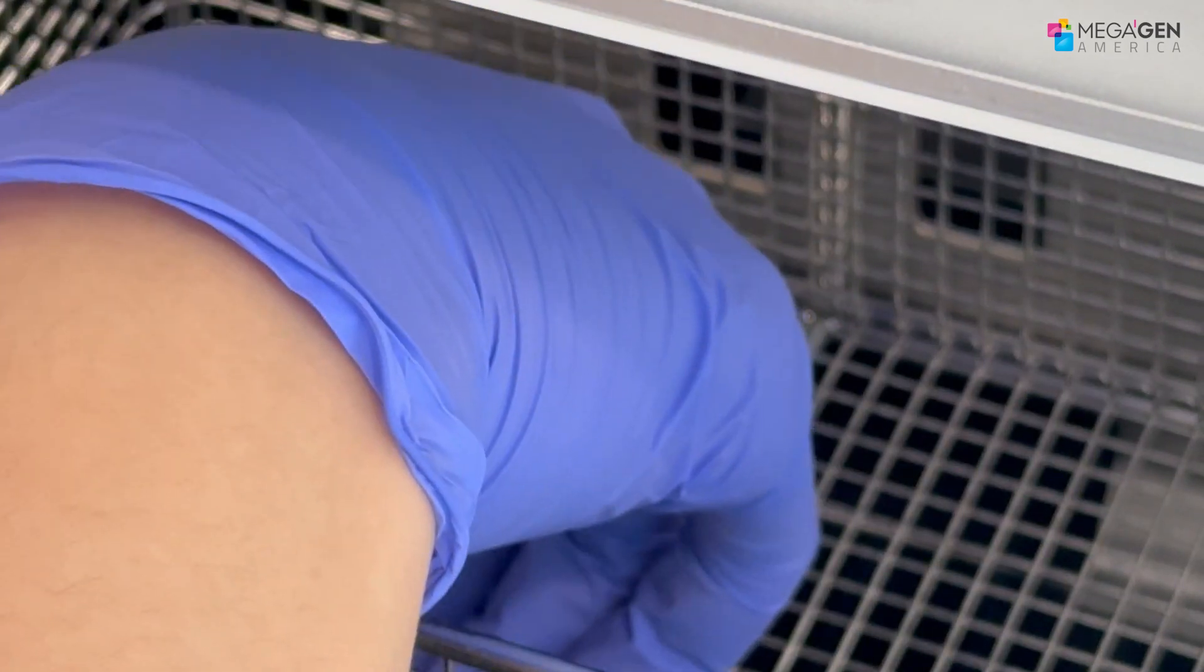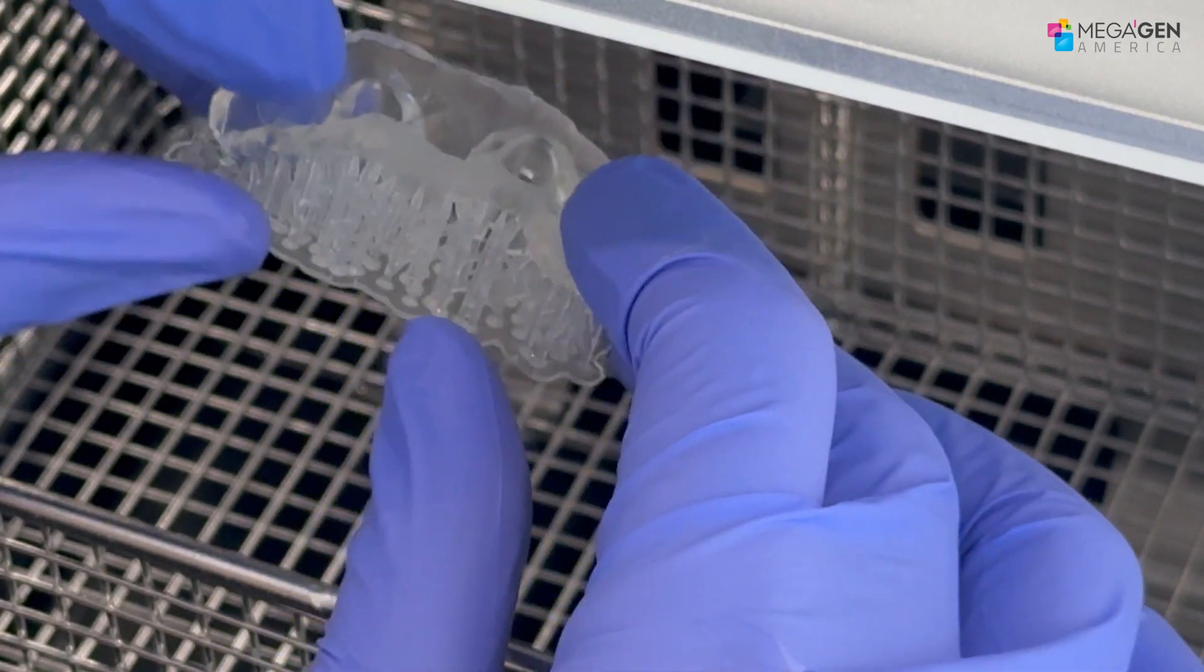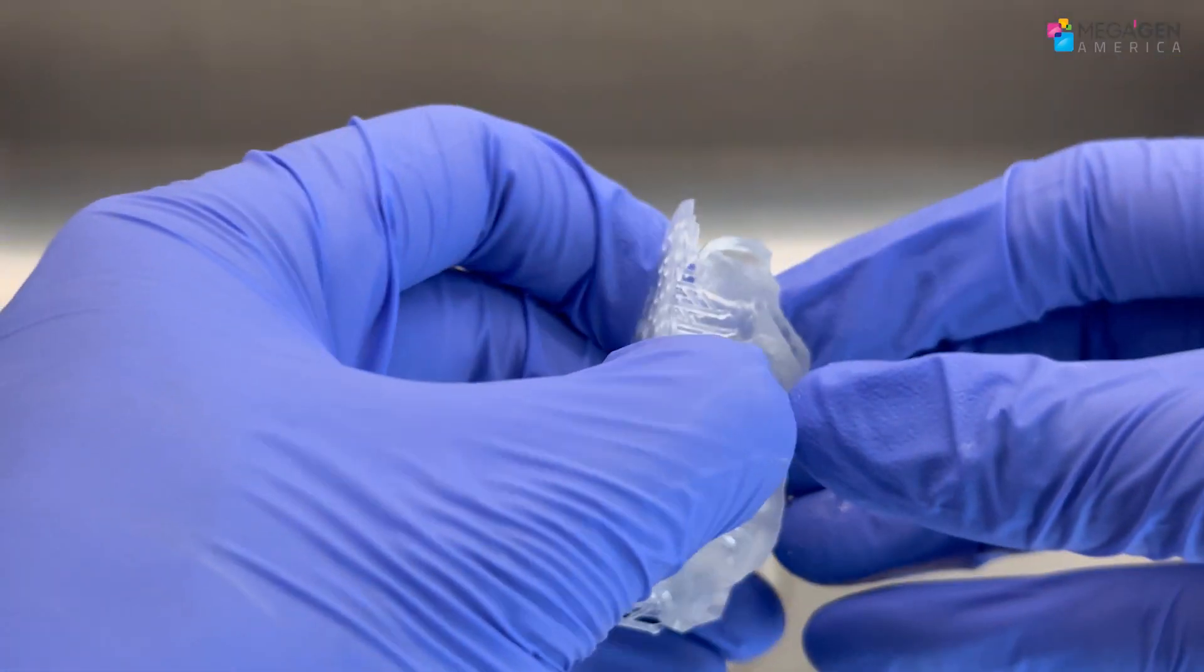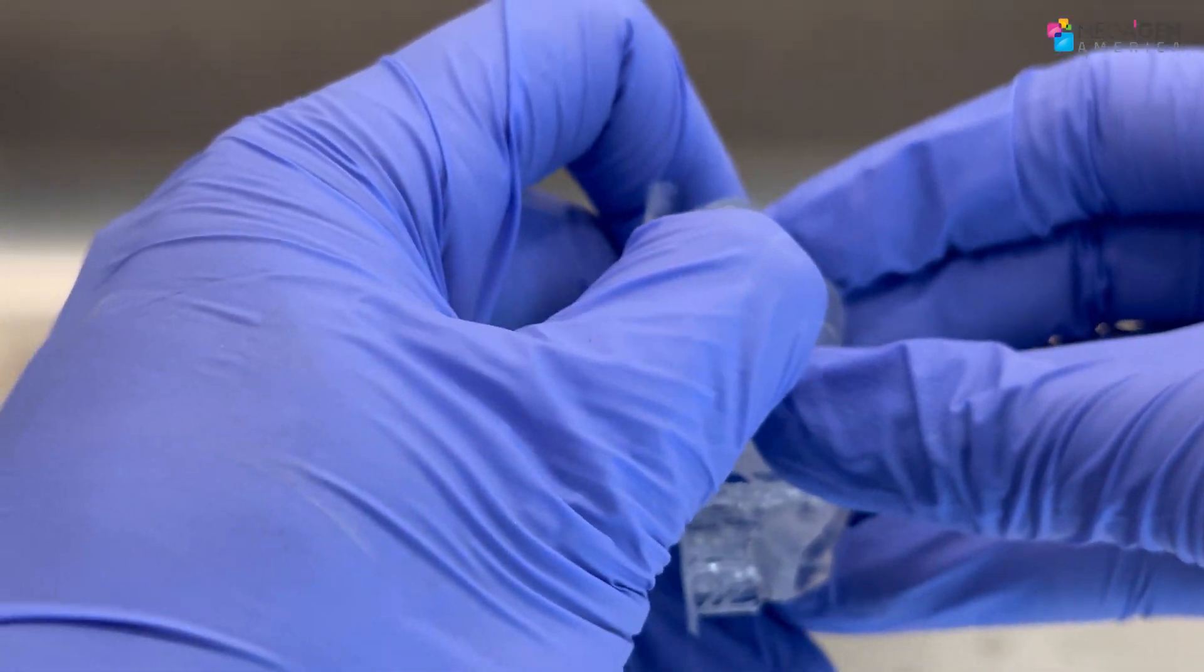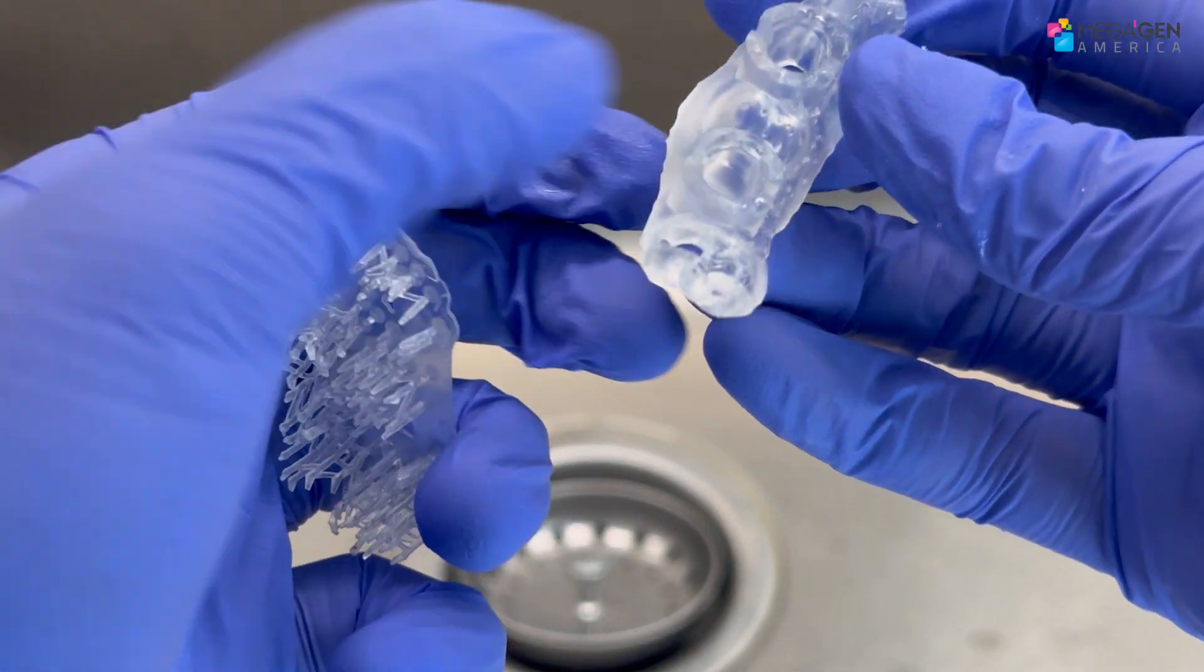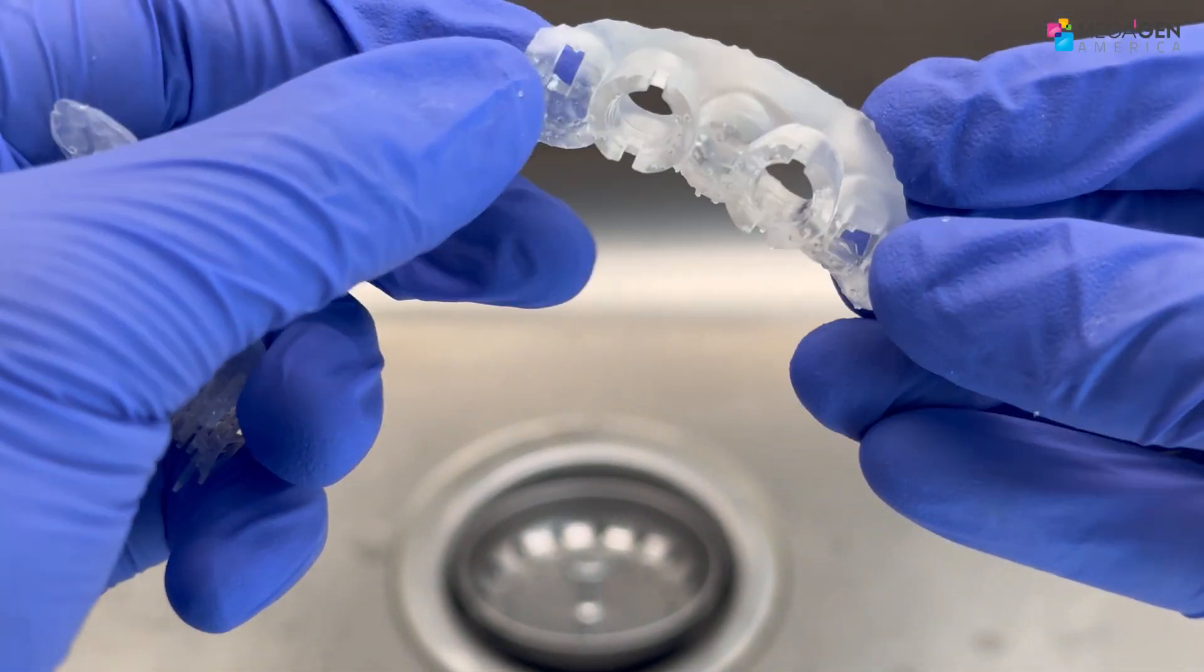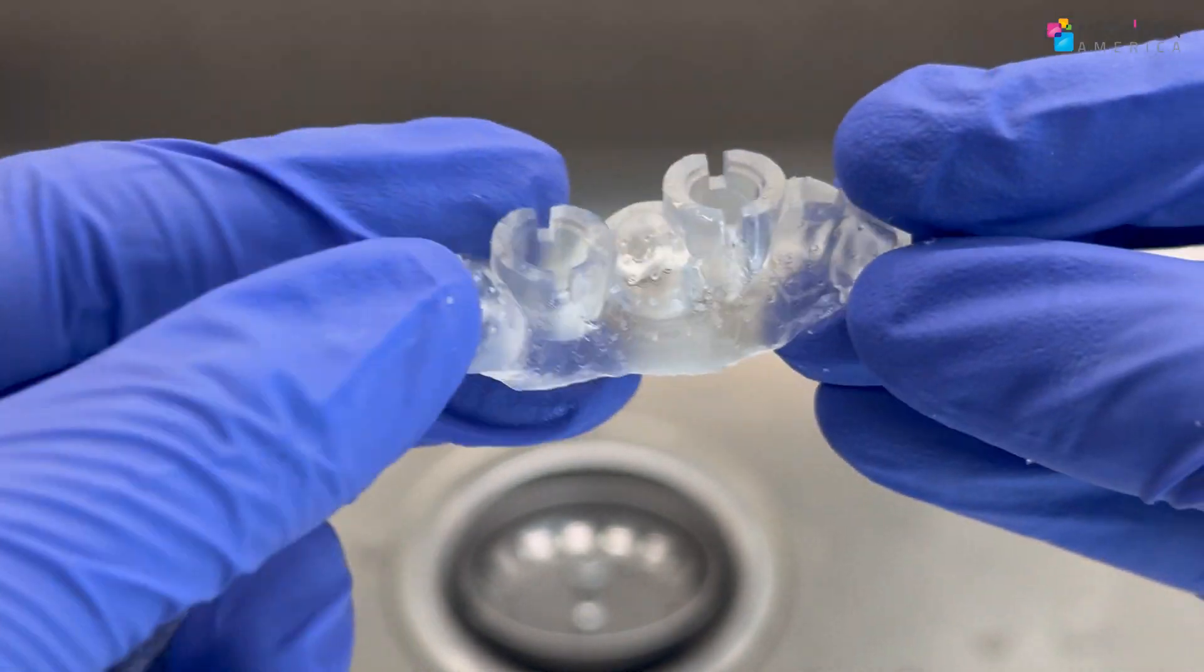Now the washer is finished, I recommend getting an air gun to dry the model and remove the support by hand. You can air dry, but it'll take longer.